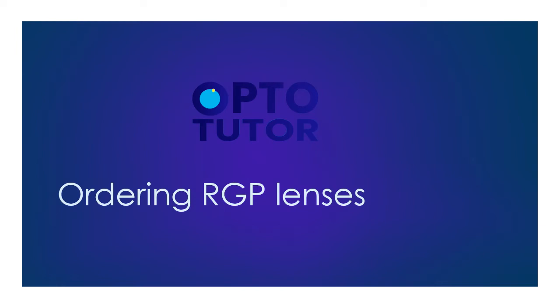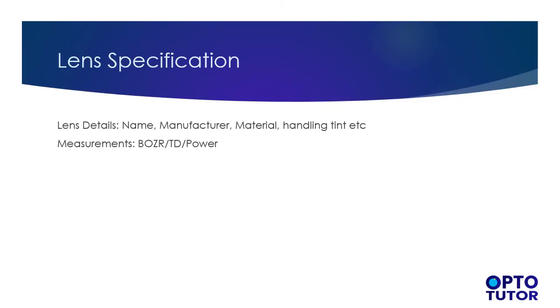This is a short video on how to order RGP lenses. When you are asked to complete a lens specification, you need to include the name of the lens, the manufacturer, the material, as well as any other details like a handling tint, for example. But the key measurements that you need to include within your lens specification is the BOZR, the TD, and the power.